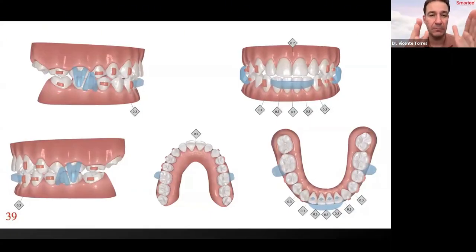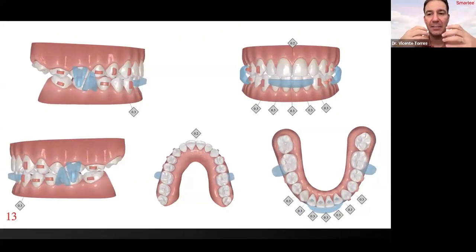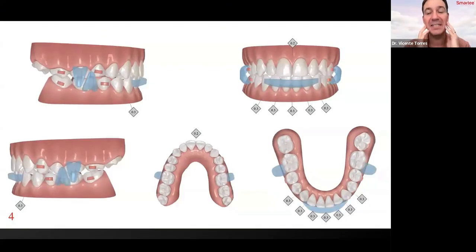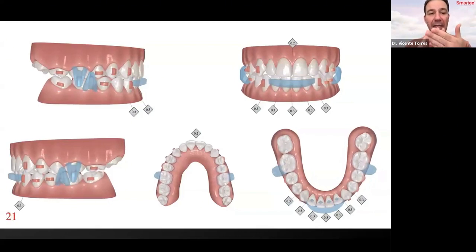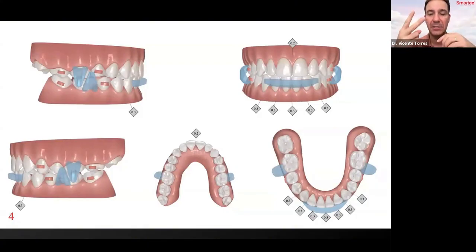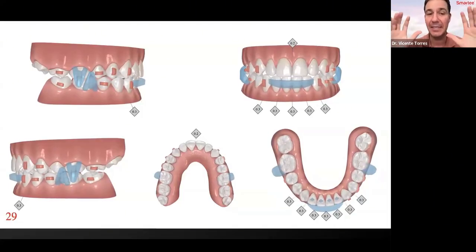So very important. And what happens with these first 3 to 6 aligners? The patient is not comfortable. It's very uncomfortable because they need to eat with this. And from the beginning, the patient has these kinds of movements that are not natural, and sometimes the patients may break the blocks, or in that case the HB, the wings. So these two aligners per stage are important, because for the first 3 or 6 stages the change is every 10 days, ideally every 10 days.